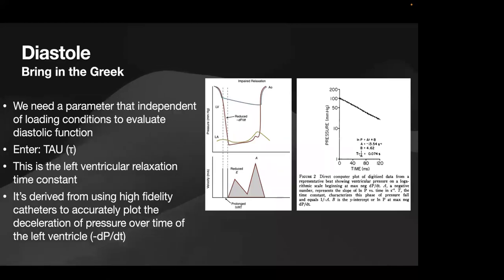And so initially the studies looked at just dP/dt, but what they found out was that that is actually not only challenging, but it had its own issues because we're measuring a rate of change of pressure, and pressure, like we said, will actually have a large impact, both of the driving pressure of your gradient, LA to LV, and other parameters.